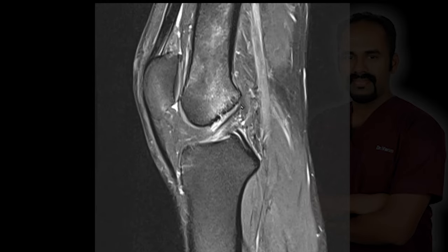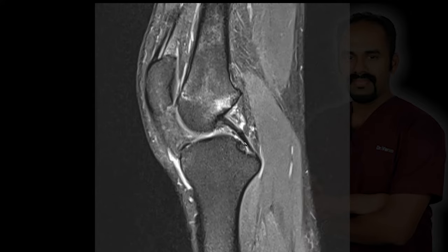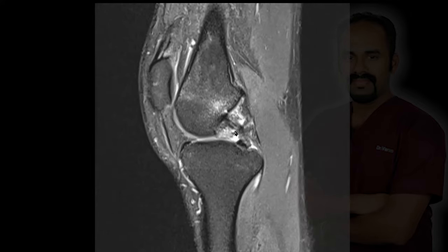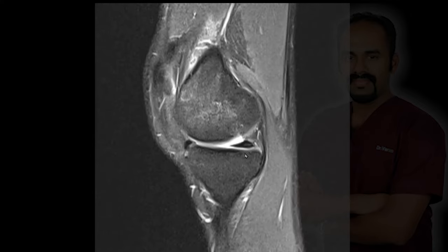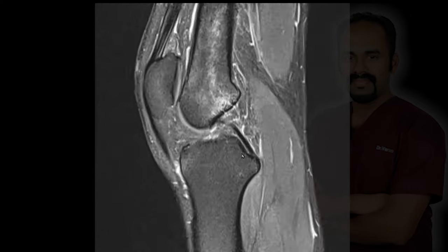The ACL fibers appear parallel to the posterior femoral margin and parallel to the Blumensaat line, but there is intrinsic high signal intensity within the ACL, suggestive of a partial thickness tear. The posterior cruciate ligament appears intact.